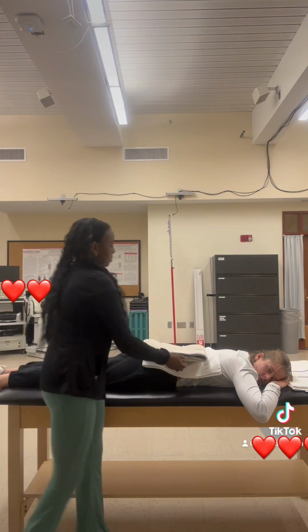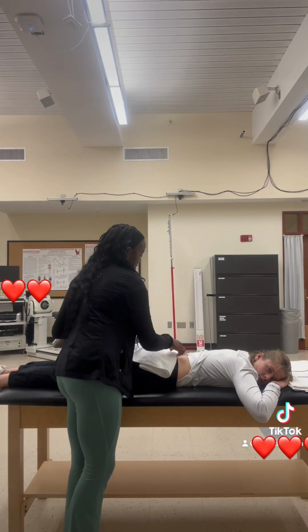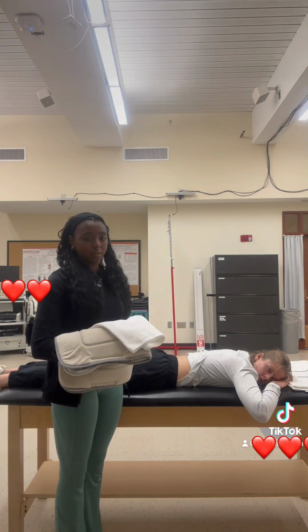Once it is time to remove the treatment, I will remove the heating pad, remove the towel, and then I would check the patient's skin for any redness or anything indicating a burn. To conclude, I would advise the patient to not use another heating modality too soon and to avoid any heavy activities to avoid overstretching of the muscle.